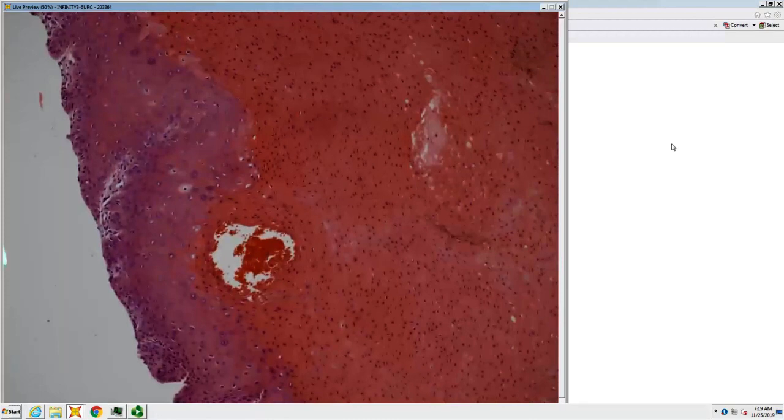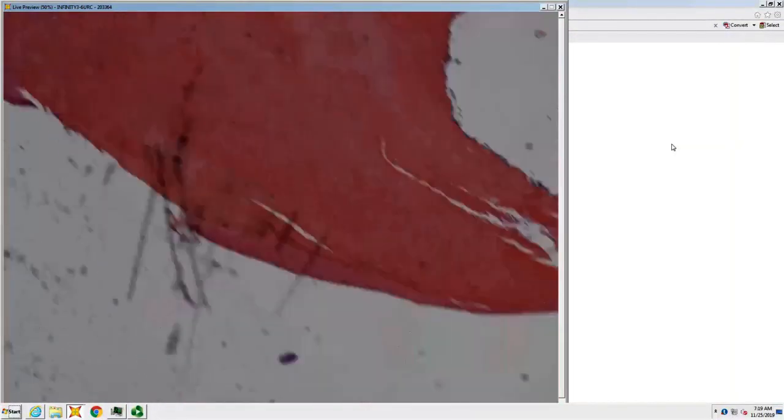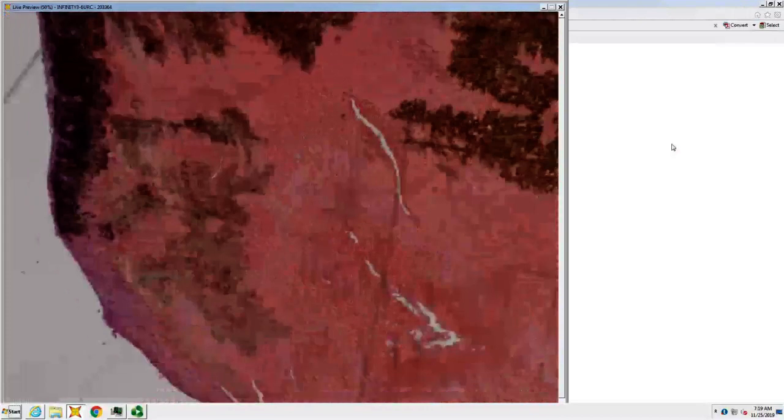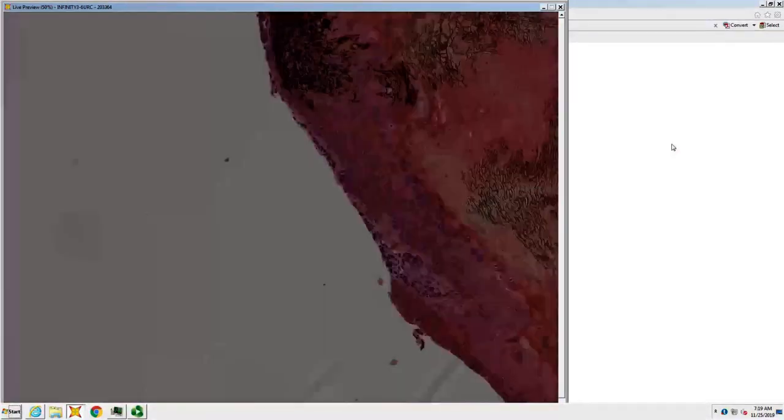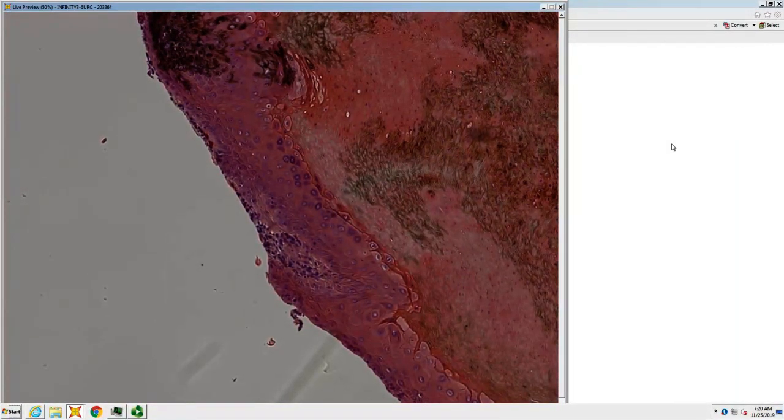So, has a little bit EDV-like blue cytoplasm, and this is a cyst. A cyst with round parakeratosis and hypergranulosis. So a proliferative verrucous cyst, and many of these, especially if they have EDV type HPV in them, go on to cystic squamous cell carcinoma. So verrucous cyst can remain benign or can go on to cystic squam.